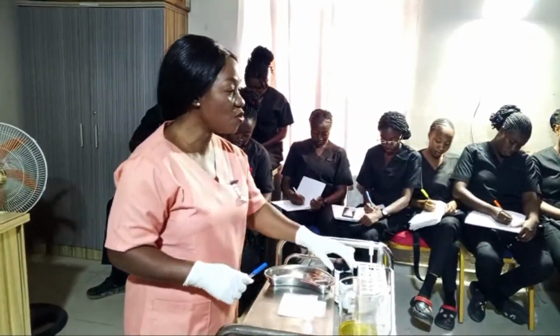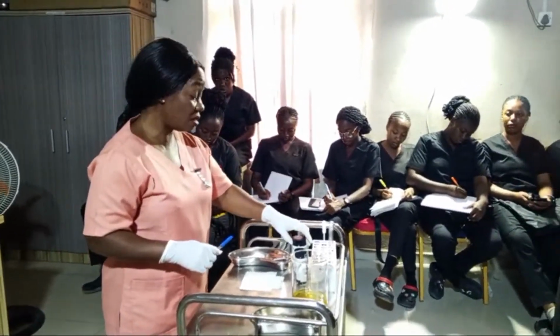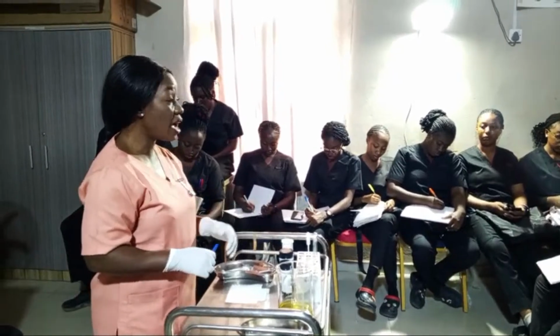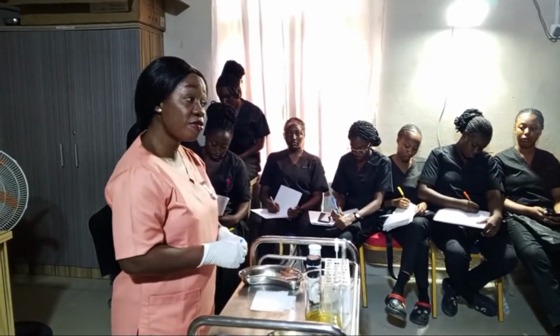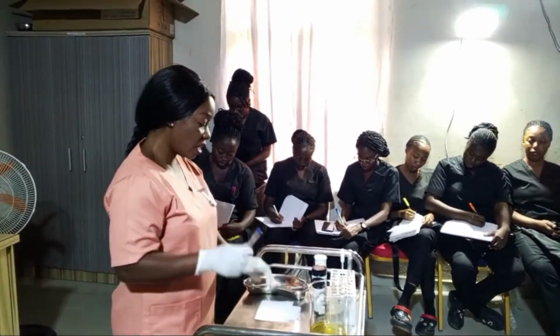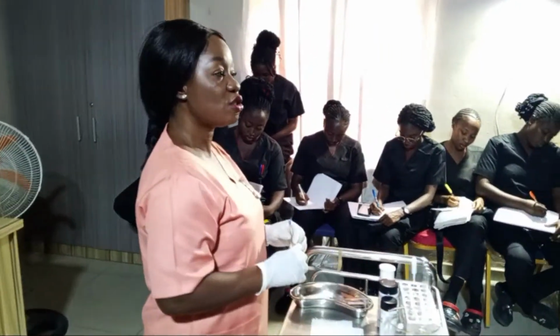Then later you use the test strip to carry out what? The chemical examination of the urine. So now I will start with physical examination of this urine.